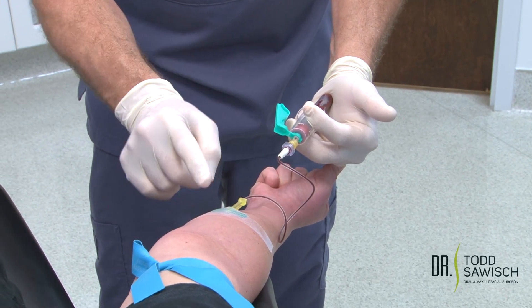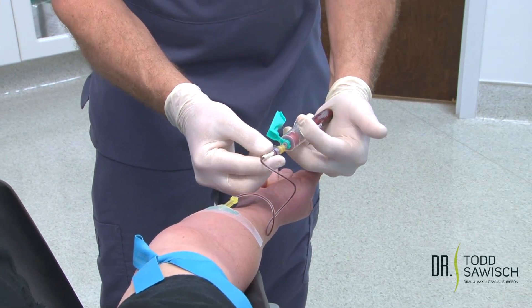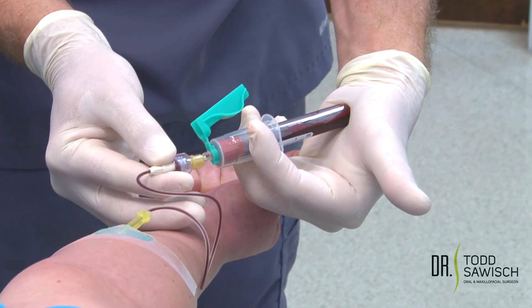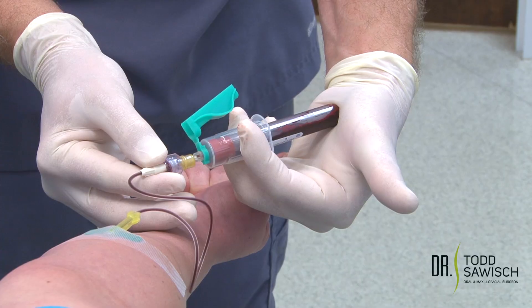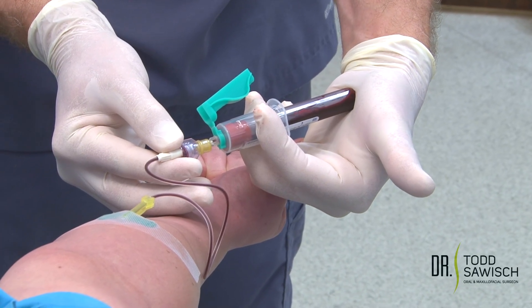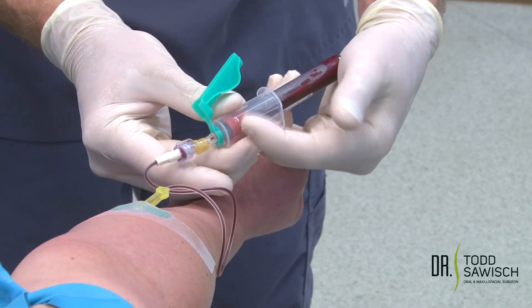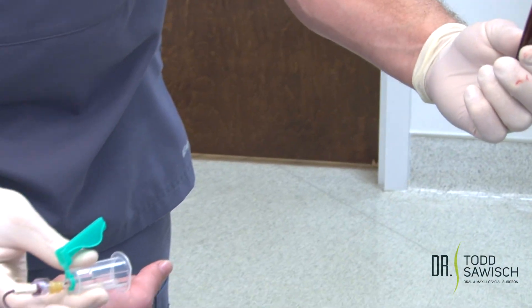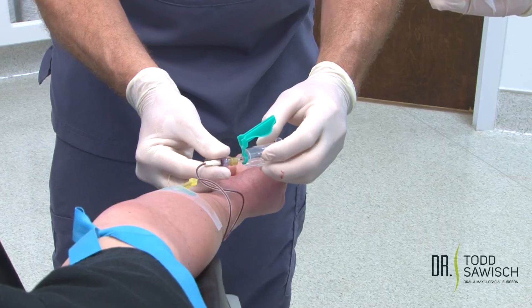We like to remove these because they're rigid — you can see the blood fill that we have. It's best to always wear gloves. Once this is done we will pull out the tube. If you need to fill up more blood, this is still connected. I'm going to hand that to my assistant and we're going to remove this.